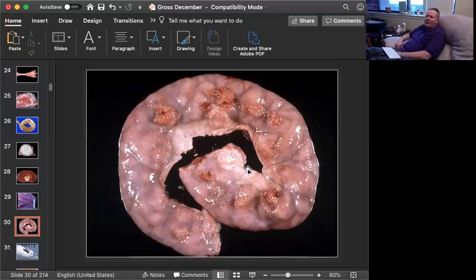It is a well-known slaughterhouse finding, doesn't mean anything. Don't know why this happens. Some people say it's Clostridium producing gas, because you might find some multinucleate giant cell macrophages around the dilated lymphatics. These are all lymphatics. But it's an incidental finding.